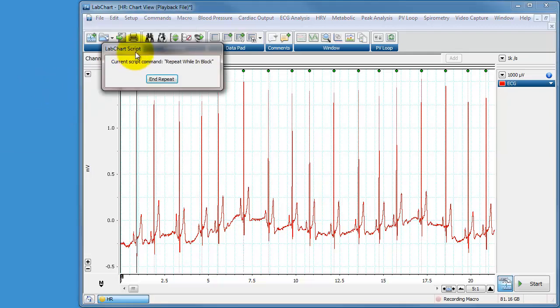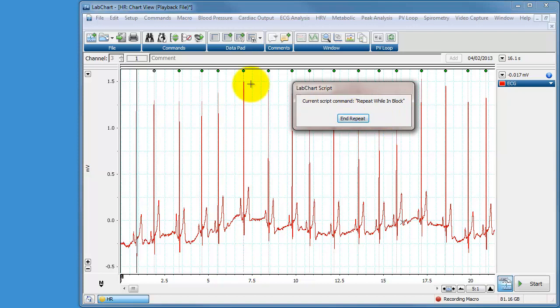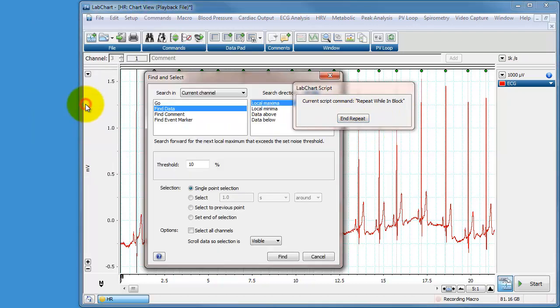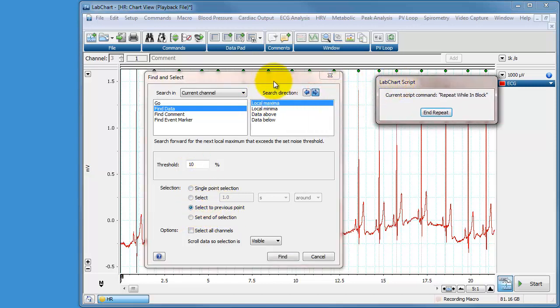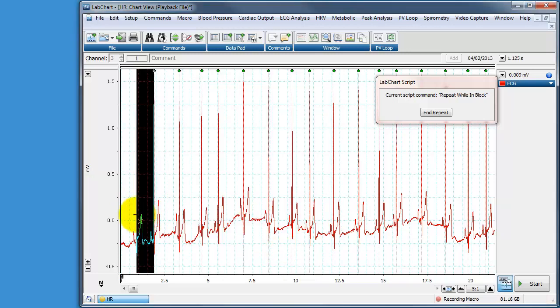A little window comes up saying we're currently within the repeat while in block section. So now we're going to go back to commands, we're going to find, and we're going to find 10% of our local maxima. 10% of our local maxima and we're going to select to the previous point. We're going to select the distance from where we just were to where we're going to go and press find. And you can see it's selected quite nicely, there's data.